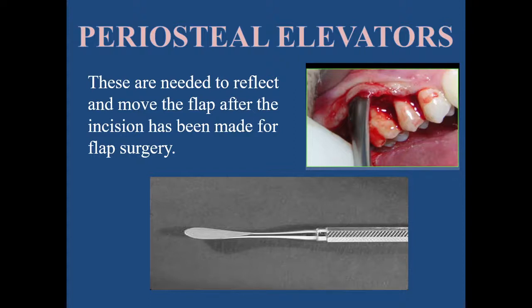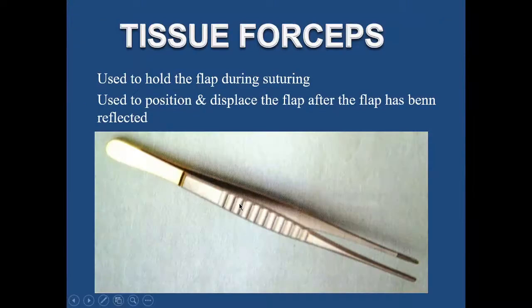If you try to peel an orange with a spoon, the convex surface of the spoon will be outside peeling the orange, and the concave surface is towards the inside of the orange, just like the periodontal tissue. So the convex surface is towards the flap, and the concave surface is towards the bone.